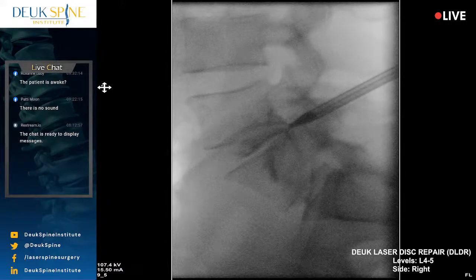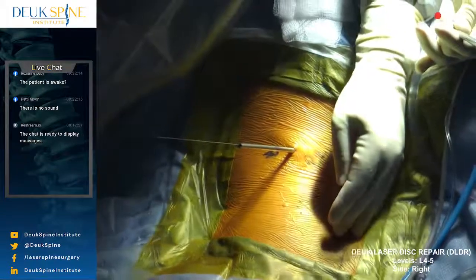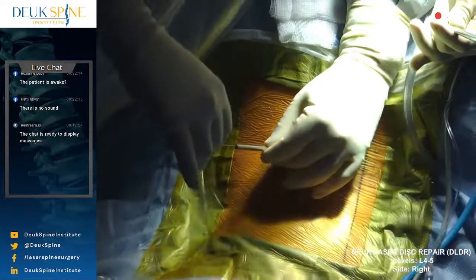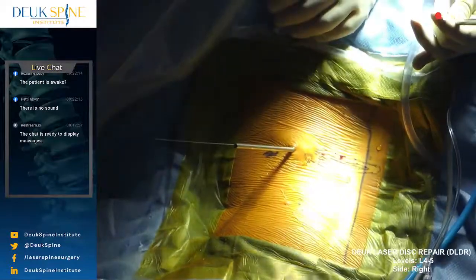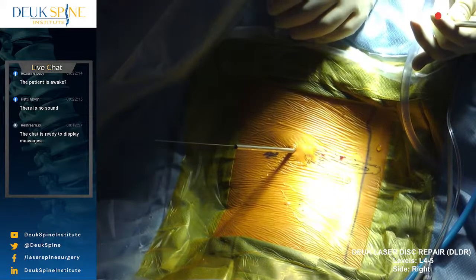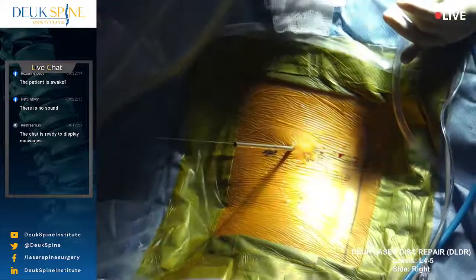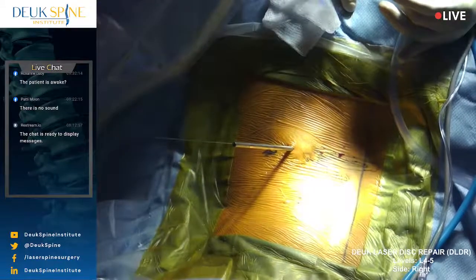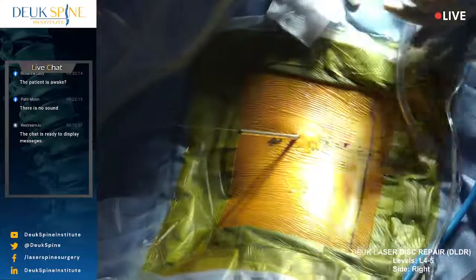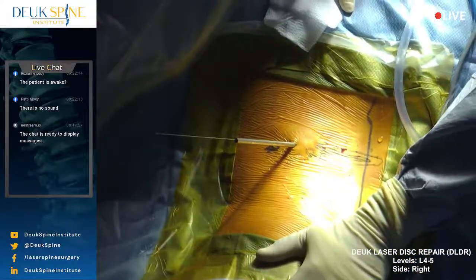Lay still. You're doing fine. Just lay still. Shot? Let me know when I can proceed. Yeah, blood pressure looks good. Let me know when he's ready for me to proceed. I'm going to wait a minute. All right.